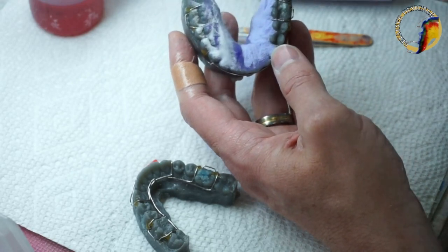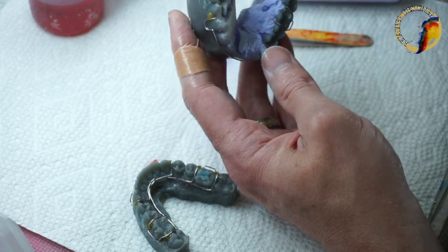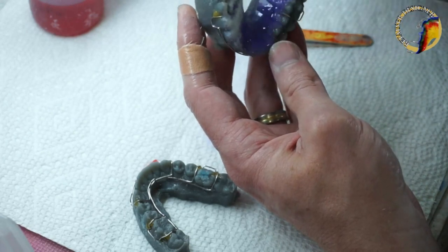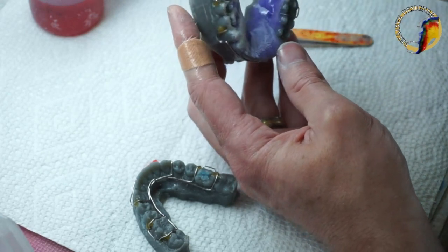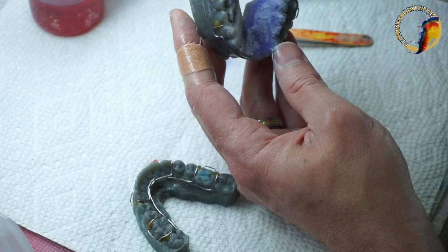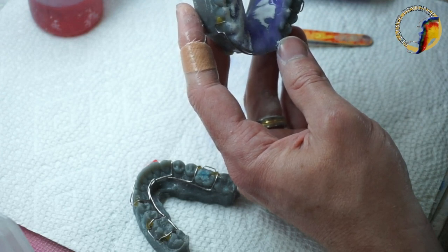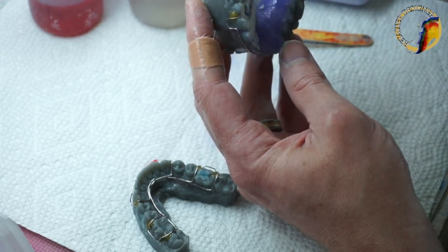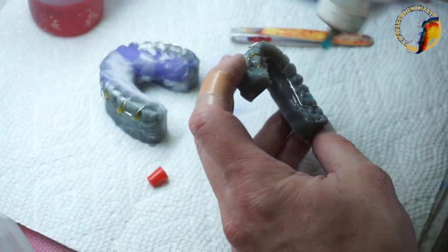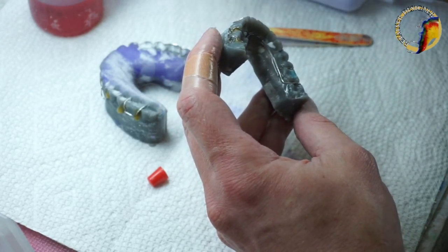This luminary blueberry tends to have the color separate — it kind of marbles a little bit. One trick is to use tiny small drops instead of big drops, which tends to keep the pigment separation small. Then you can pat it down with your finger to keep the pigments from separating. It's kind of hard when the model scan wasn't complete. I need to let it sit and cure just a little bit so I can make my cuts a lot cleaner.